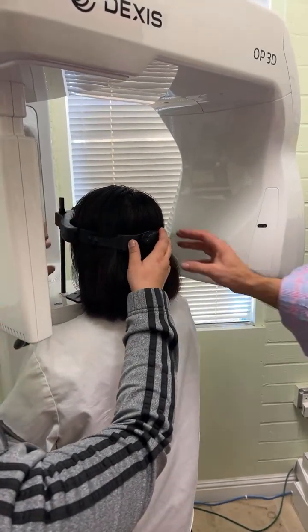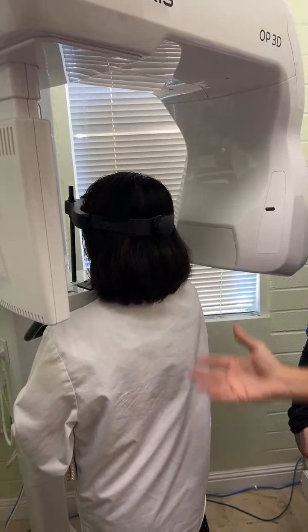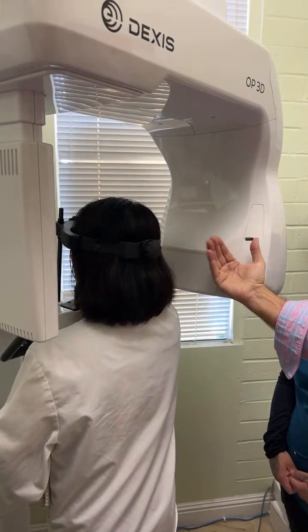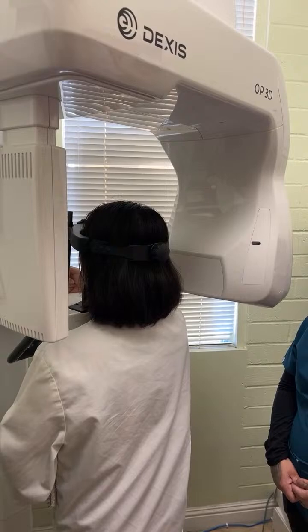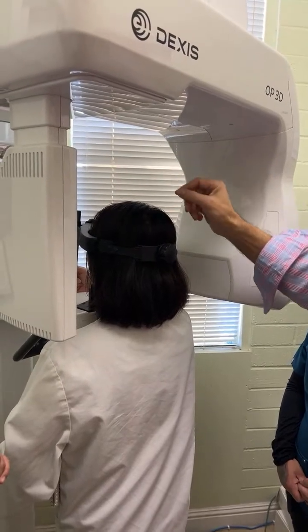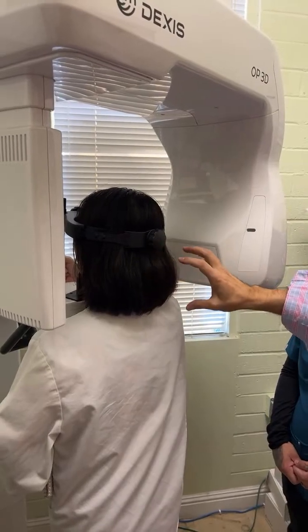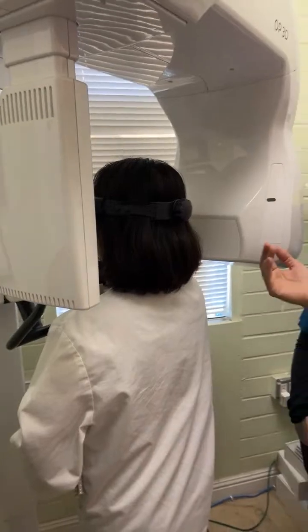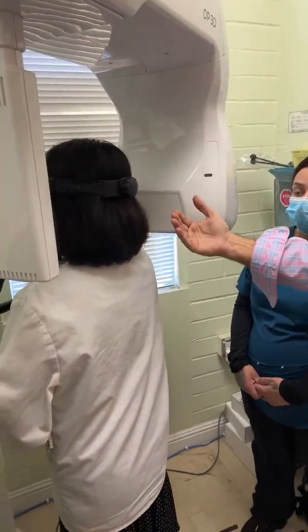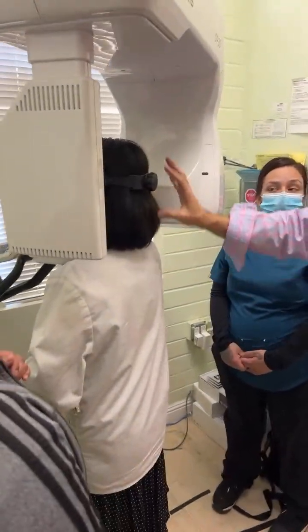Okay, so women that have a hair bun that sits out here, you want to release that. Because if it's sitting out here, when this tube head rotates, it can hit it. And then their whole head is going to twist. The top one's not really an issue, but a big ball of hair or hoodies, these big hoodies that sit out here like this. This has to rotate around their head. And if it hits anything back here, it's going to move the patient. So you want to make sure nothing is obstructing.